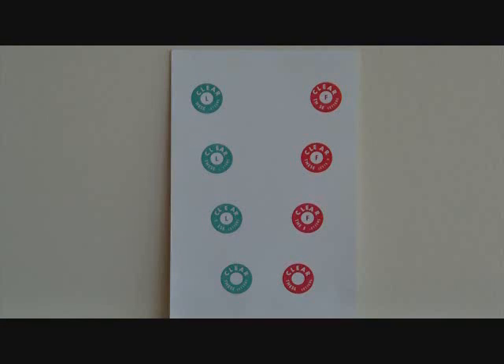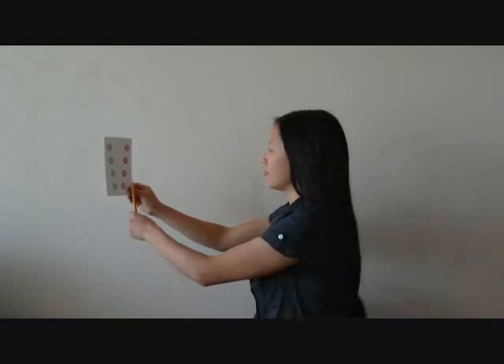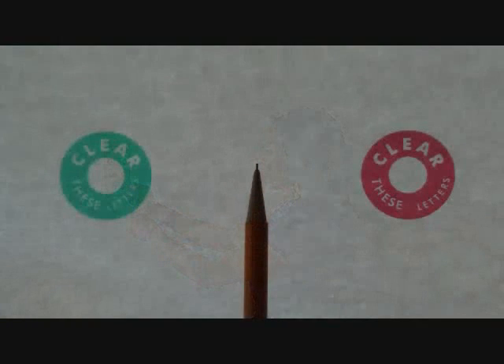We will be using the opaque Lifesaver card to help move your eyes in. Hold the opaque Lifesaver card at a reading distance at eye level in one hand. With the other hand, hold a pencil right in front of the card so that it is positioned between the two lower circles.